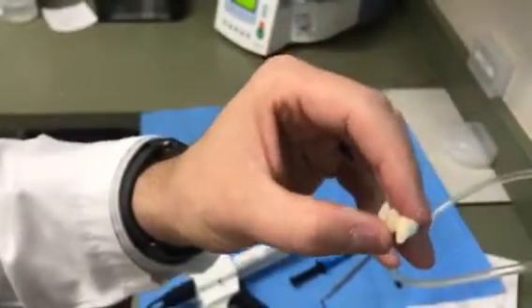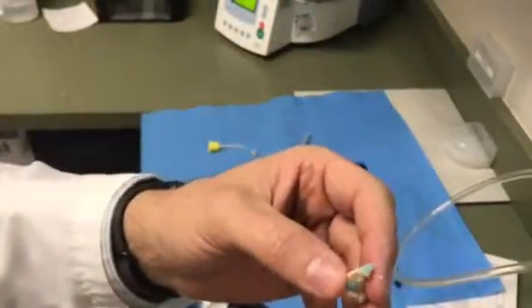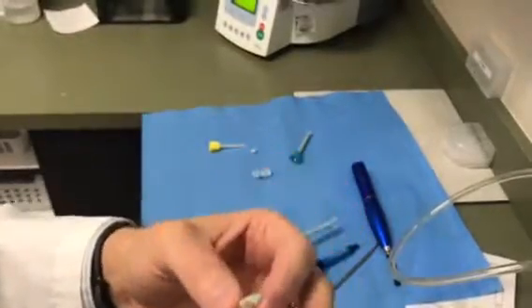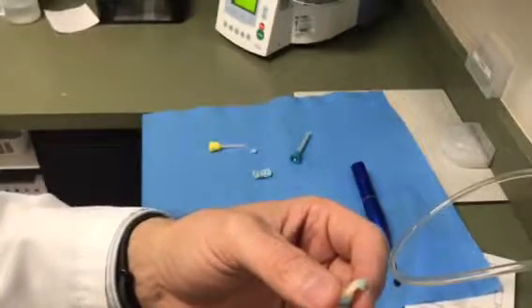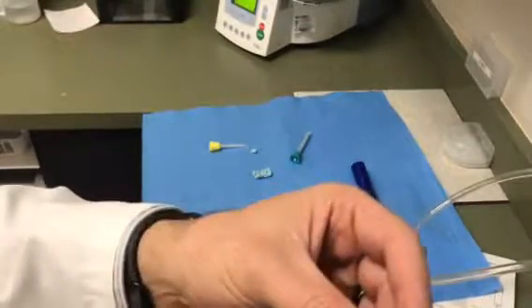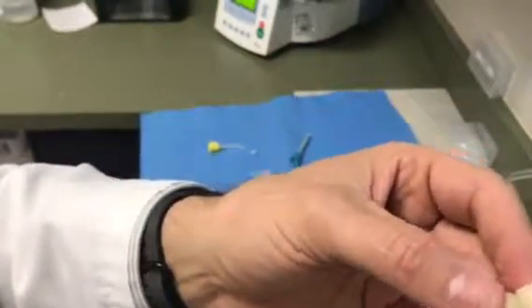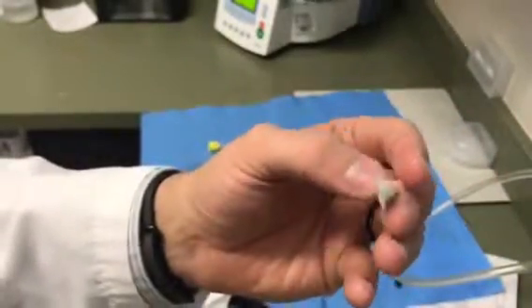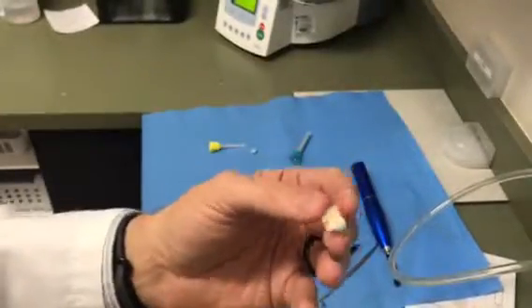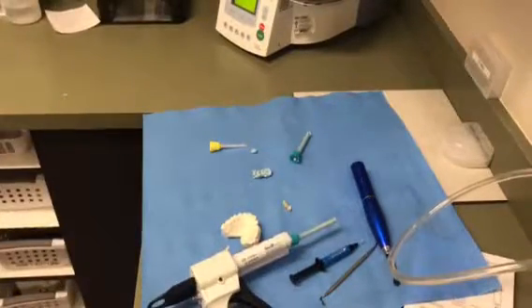So the methods you have, of course, are just take a picture and communicate it verbally. You can shave the model. As talked about, we don't have those little thickness gauges, but you could use thickness gauges just like a machine shop would have. You can use this method where you're actually giving the lab the contours for exactly the way it needs to be. So, anyways, those are the methods that I use for communicating with the lab how to change the contours of my bridges, how to change the contours of my crowns.